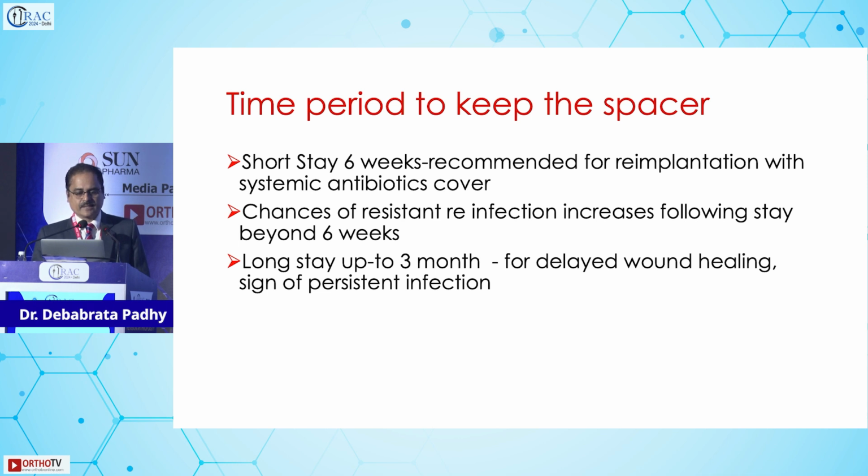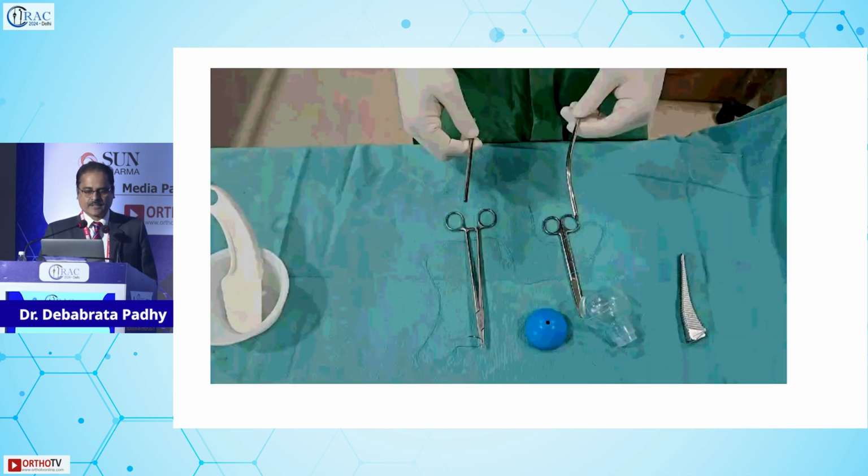Chances of resistance and reinfection increase following a stay beyond 6 weeks. A long stay up to 3 months may be needed for delayed wound healing and signs of persistent infection, which should be taken into account. So this is how you make a cement spacer.